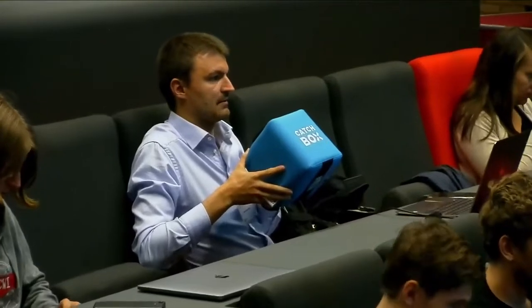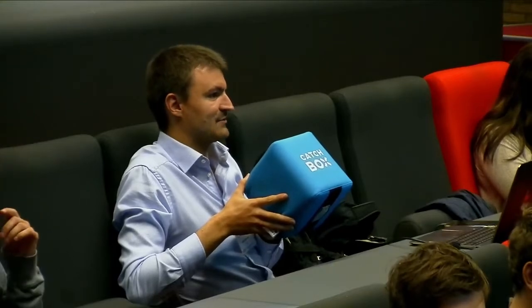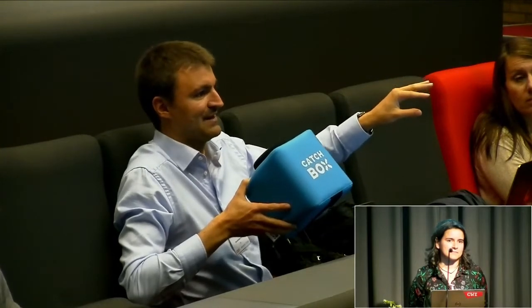Thanks for the nice presentation and also the insights on the different outcomes from different CT scanners on the gray values, and that's where my question starts. If I remember my education correctly, medical CT scanners usually work with Hounsfield units, and they also are commissioned by a standards institute, and you get a phantom, and then you should arrive at the same Hounsfield units. So I presume that the fix for your problem would be to use the same phantoms and reach the same Hounsfield units, and then work with that standard instead of working with the gray values.